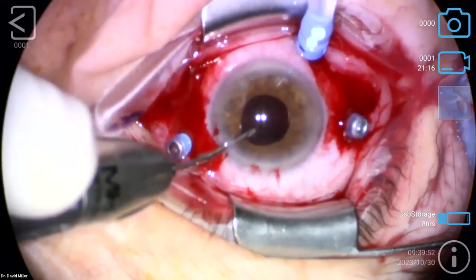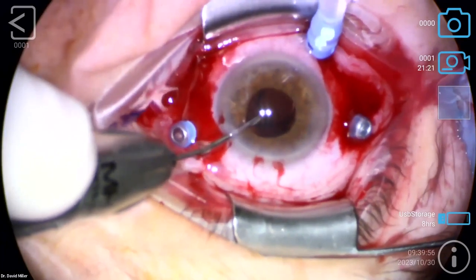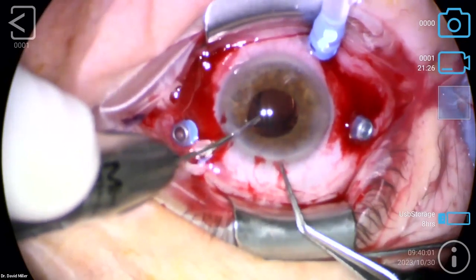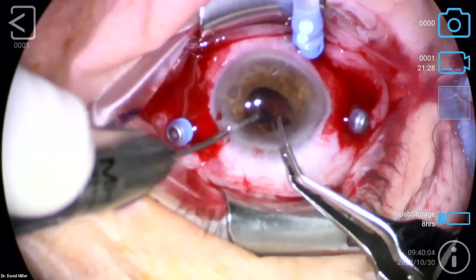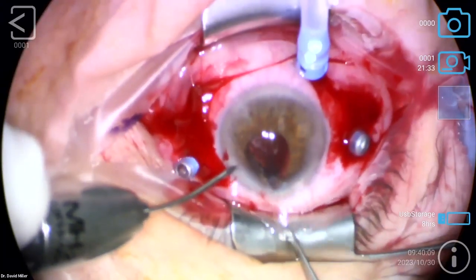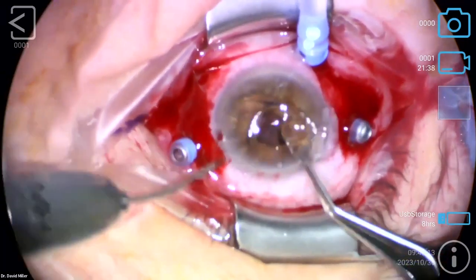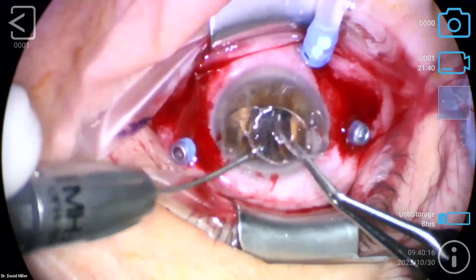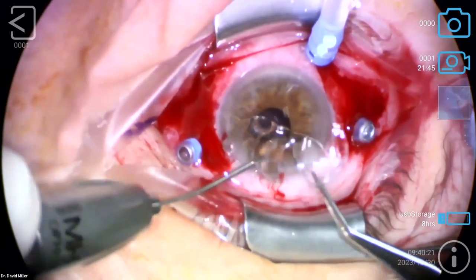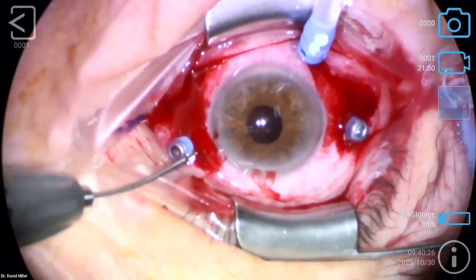And then you can see about how far I cut. Do you have that McPherson forceps? So you can see how I cut it. I don't get too particular about which side I'm pulling on or whatever. This one's going to work out nice because of the way the haptic is situated there. And you kind of just stretch and it follows itself out like so. So that's our lens implant right there. See how we cut it? Kind of like Pac-Man. That's the Pac-Man thing they talk about. And it's like a gummy type material.